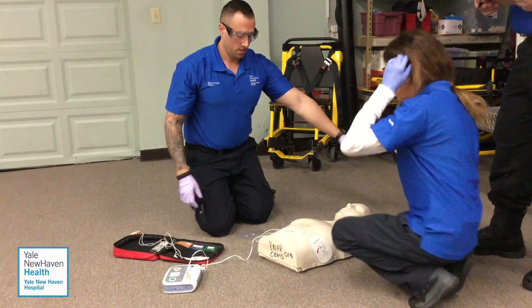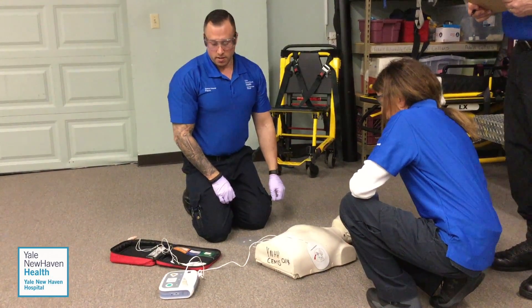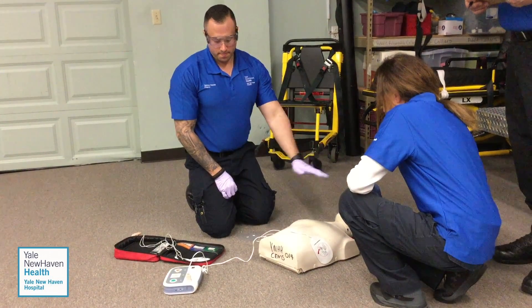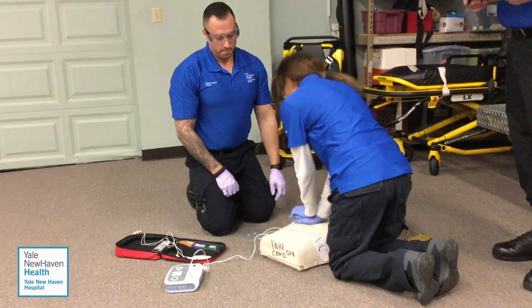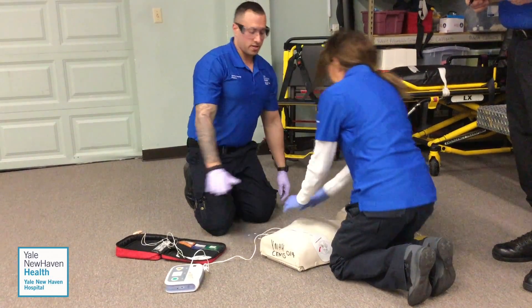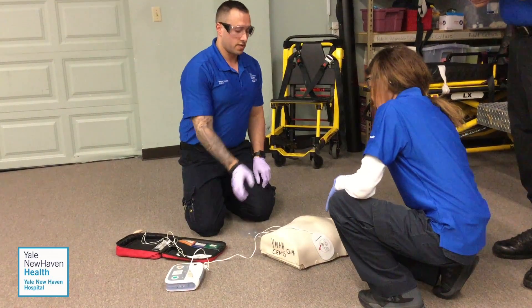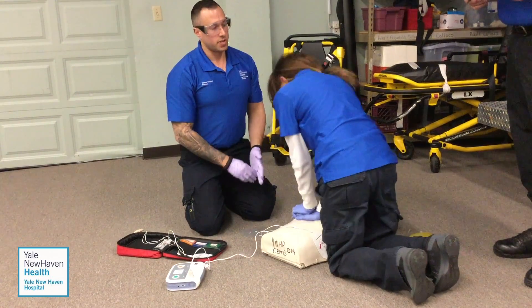Stop CPR, analyzing. Nobody touch the patient — everybody clear. Stay clear — again, everybody clear. Delivering shock. Shock delivered. Continue CPR please — begin CPR. I have completed the station.